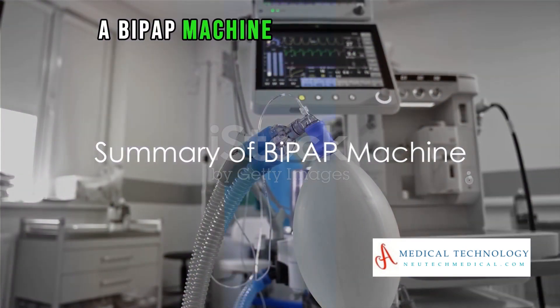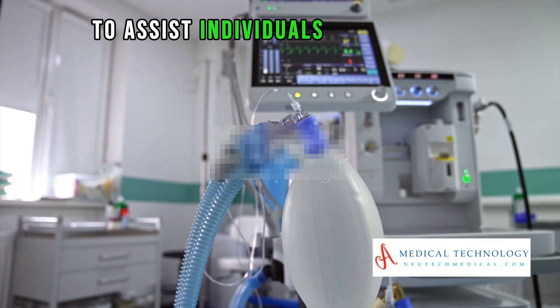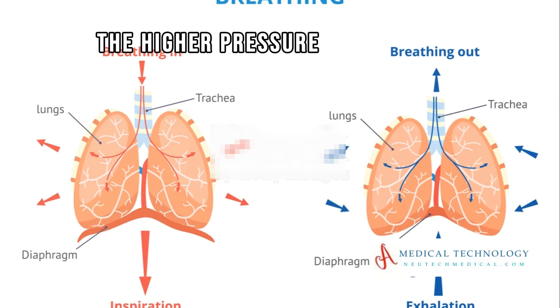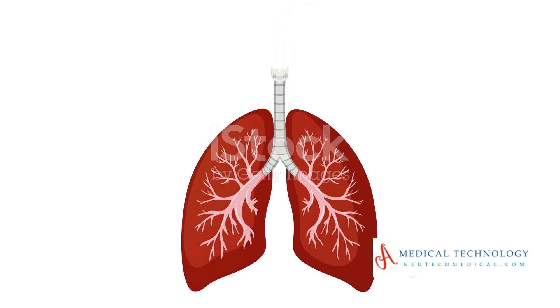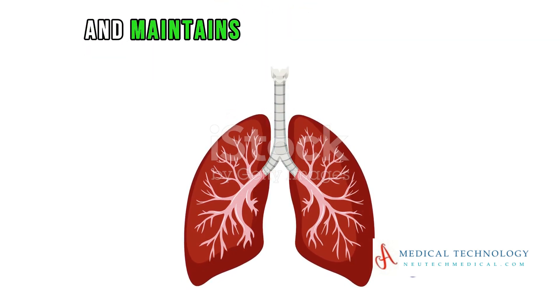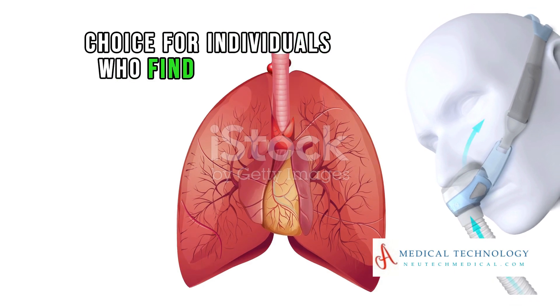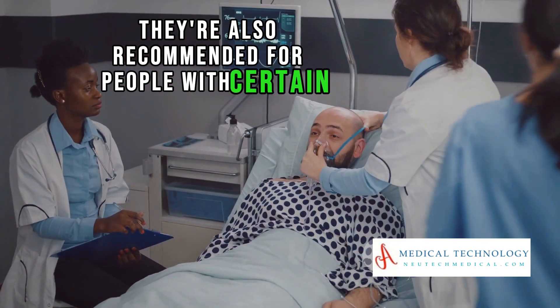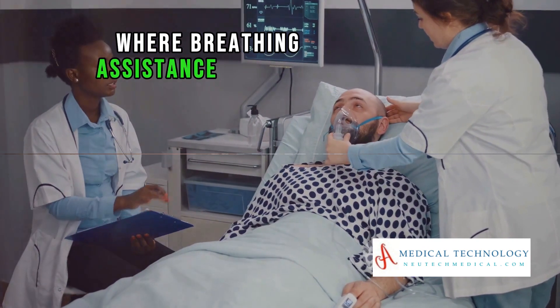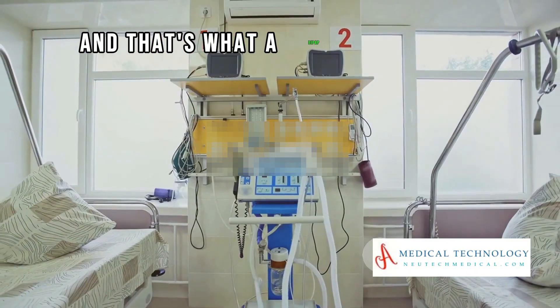To sum it all up, a BiPAP machine delivers two levels of pressure during the breathing cycle to assist individuals with breathing difficulties. The higher pressure during inhalation, known as IPAP, opens the airways and facilitates air entry into the lungs. The lower pressure during exhalation, known as EPAP, prevents the airways from collapsing. BiPAP machines are often a preferred choice for individuals who find CPAP therapy challenging, and are also recommended for people with certain respiratory conditions.